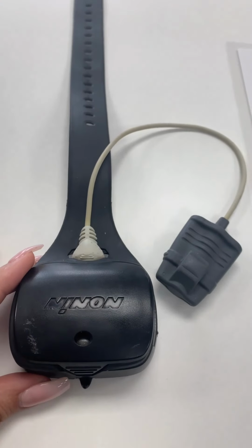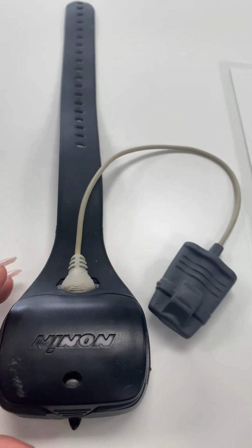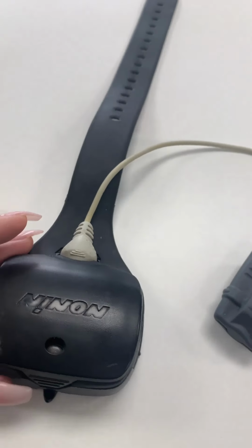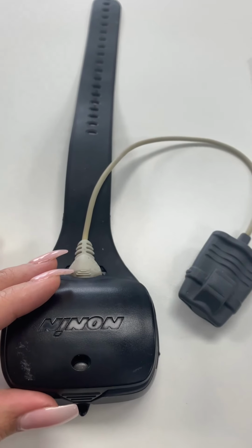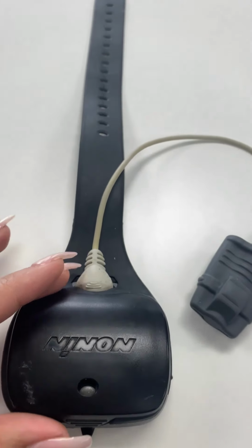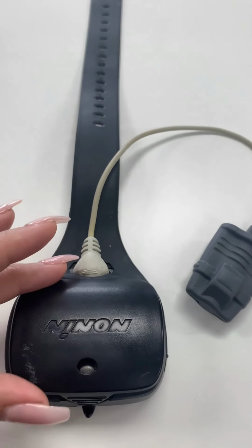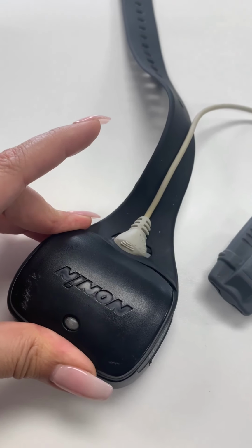Alternate oximetry. If the oximeter provided in your kit resembles the one without the screen, it's basically the same steps. However, in order to activate it, you need to press down on the lid.